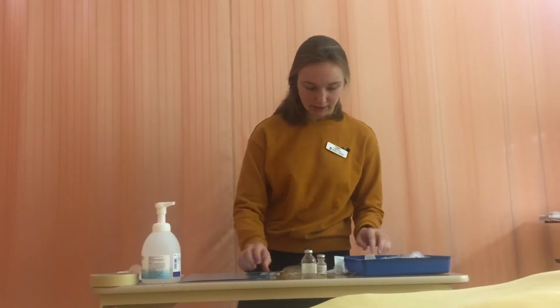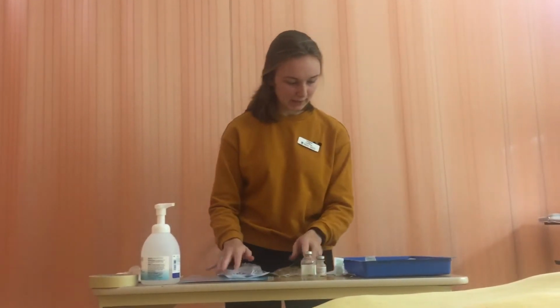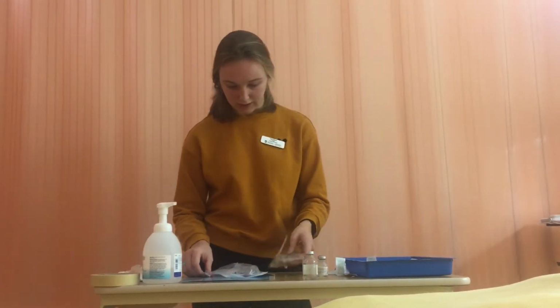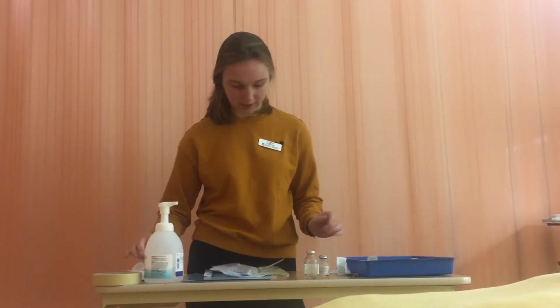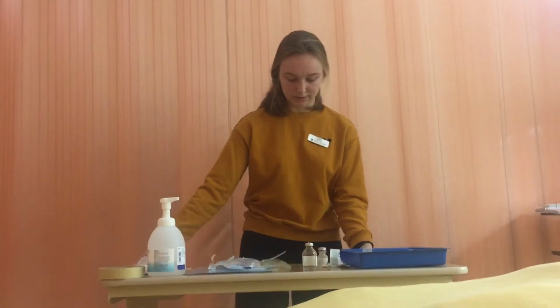Now I'm going to get my supplies ready to go to the bedside, so I'm going to have an alcohol swab, my secondary tubing, and my MAR, and I also just have a blue cap in case we need one. And my label for my tubing. So now I'm going to go to the bedside.